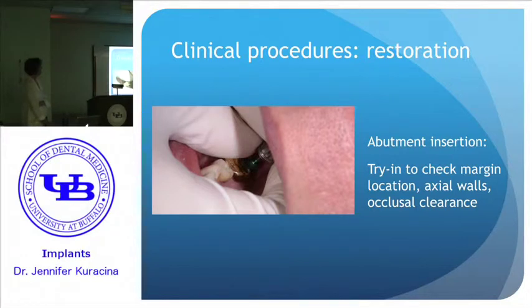Abutment insertion. One thing I try to be aware of with students is remembering that the last time they used all of these little screwdrivers and little parts was back between their 2nd and 3rd years of dental school, and most of them are now in their 4th year. And these are all really tiny parts, and you know how you fumble around with these things the first time.